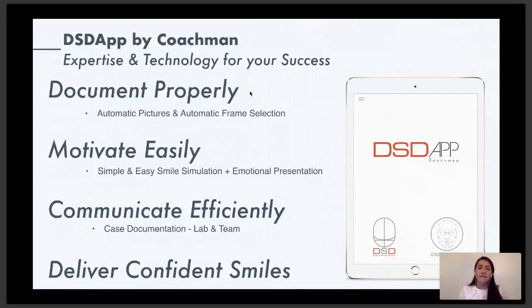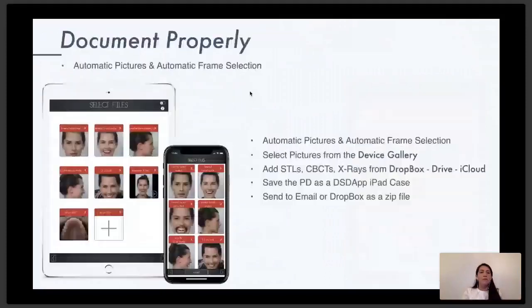Then you can communicate efficiently your case documentation and your patient's documentation with your team, like I said before, with your lab, with your specialist. You can communicate all of that through the app. And at the end, we are able to deliver those confident smiles with the 3D smile simulation, transferring that smile design that we did in 2D to 3D and then to our patients via the intraoral mockup. So the app can help you in all of those ways, and I'm going to explain a little bit about each one of these right now.